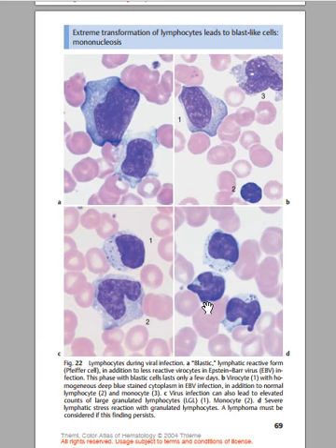Is it clear? Now in this case, infectious mononucleosis, you see a big nucleus, one single nucleus like that, and then inside the cell there is granulation which is azurophilic or basophilic. So when you see a large cell like that, you can think of granulated lymphocyte. A lymphoma must be considered when the finding is persistent. When you consider lymphoma, what may make you rule it out is to do a biopsy of the lymph node. If it is normal architecture of the lymph node, there is infectious mononucleosis.